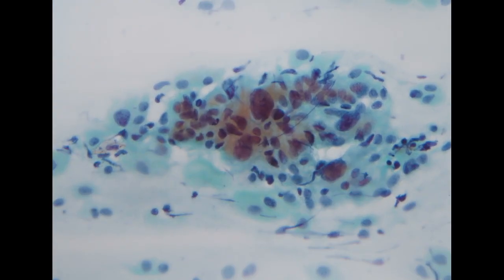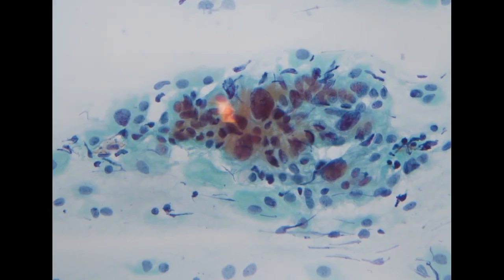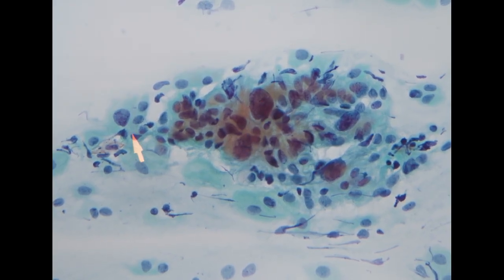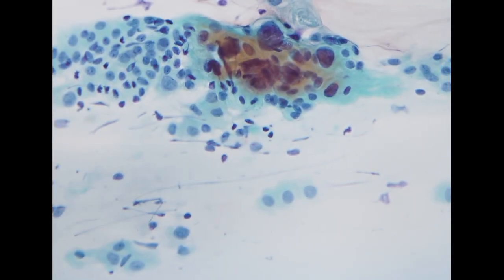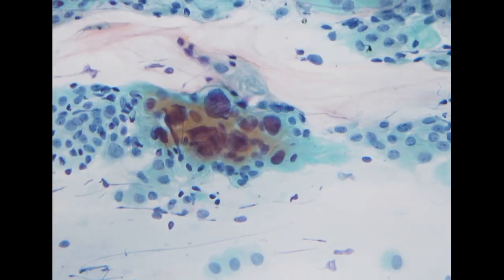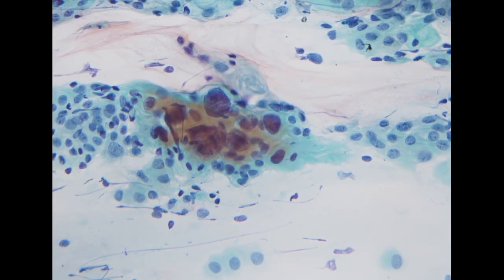dysplastic lesion. I think in this particular specimen, these enlarged cells are a little bit too much for atrophy. It shows hyperchromasia and it shows clearly a bit more coarse chromatin pattern. And these types of cells are actually not uncommon to see throughout the entire specimen. So in this situation, I would call the case atypical squamous cells, ASCUS.